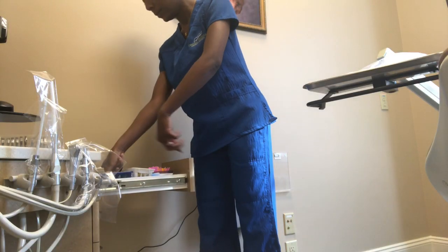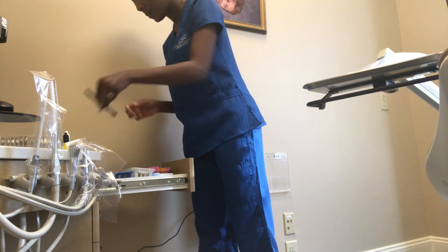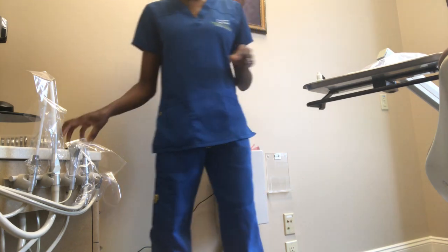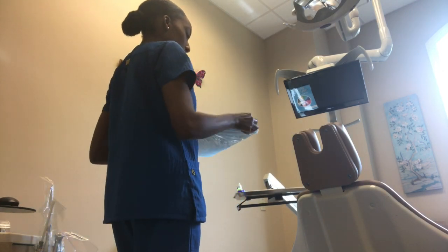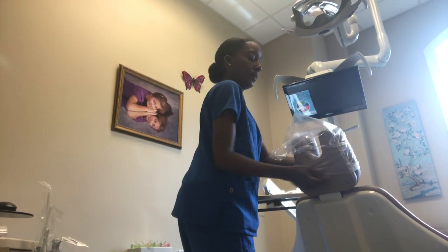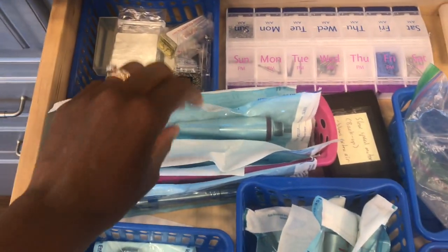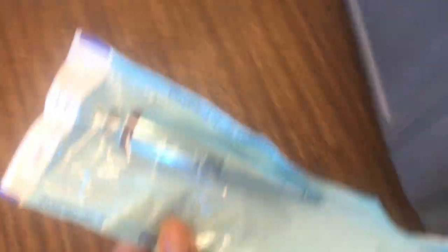Now I'm going to grab out additional things that I will need for this bonding appointment. We do keep extra things in the drawers at our station. You'll quickly notice that we keep headrest covers over all of our trays. I'm just removing the headrest cover from the tray and getting it dressed onto the chair so it's ready for the patient. Here I'm grabbing the handpiece for the prophy head — we do prophy all of our patients' teeth before we get the braces on.